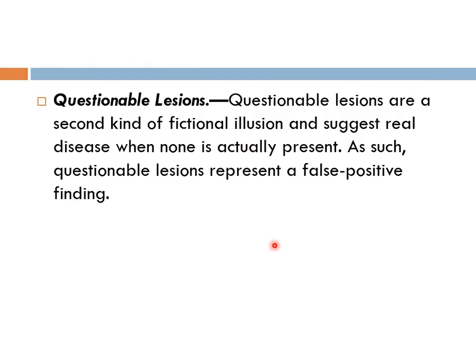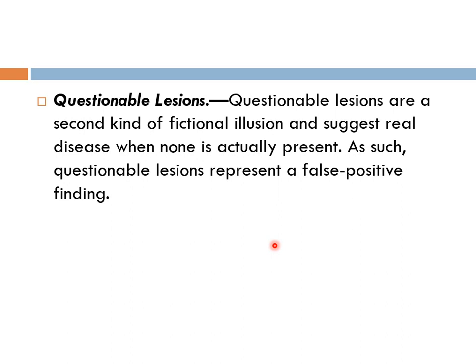Questionable lesions are another type of fictional illusion — they suggest real disease but it is actually not present, mostly leading to false positive findings. For example, in the proximal humerus there appears to be a lytic lesion, but when CT and MRI are done there is nothing — it is commonly mistaken. In another example, B, there appears to be an aneurysm in the basilar artery, but when repeated there is nothing — it was formed by a motion artifact.